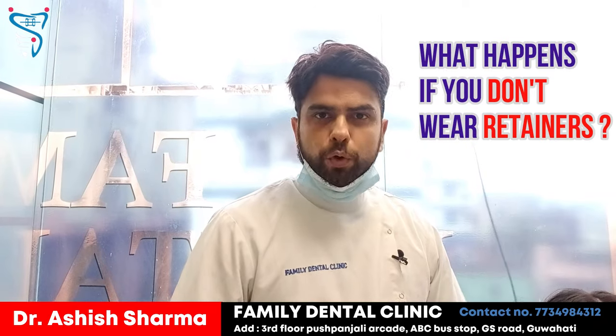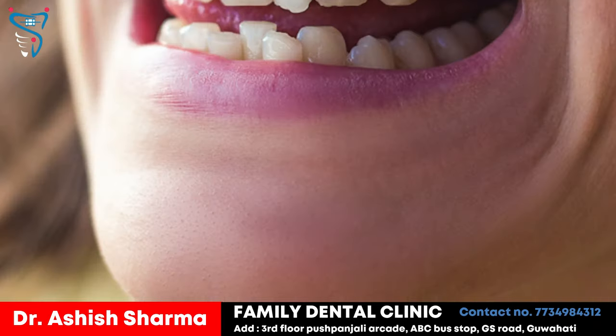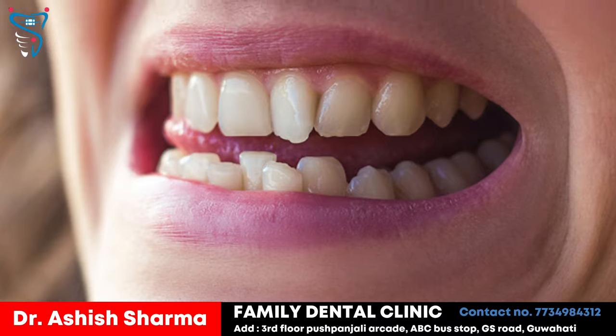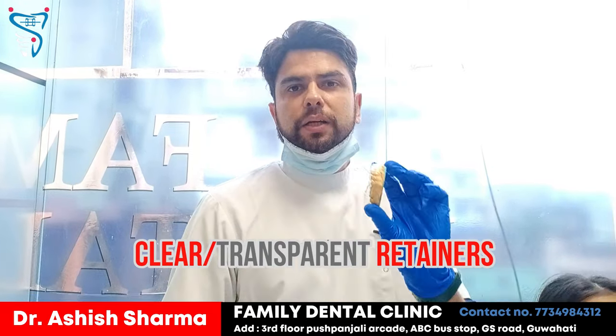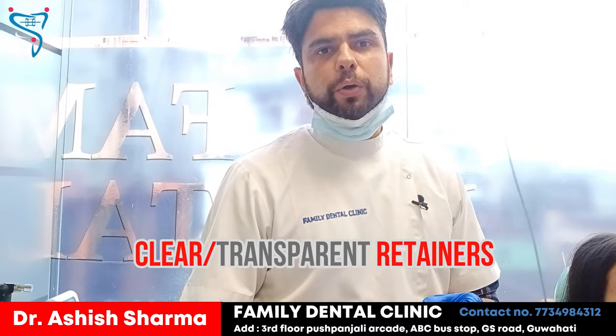If you don't wear retainers, there are chances of relapse. The stability of the teeth is not going to stay and the teeth can again go back to the same position. So today I am going to show you about Essex retainers, or the plastic sheet retainers.